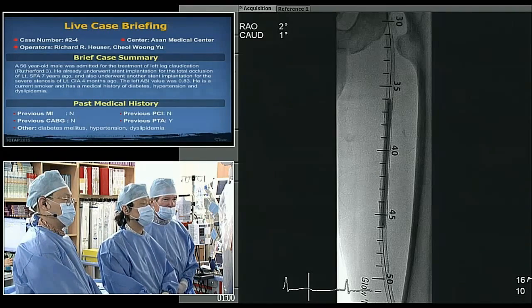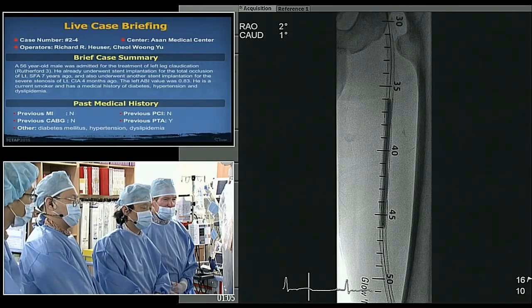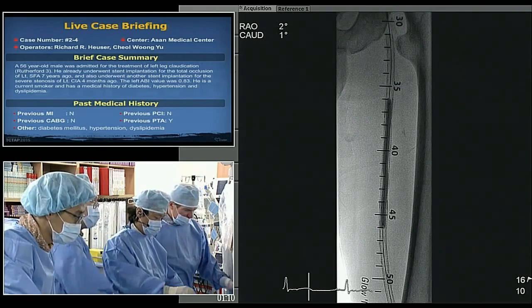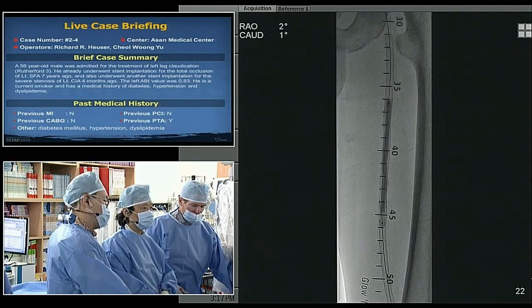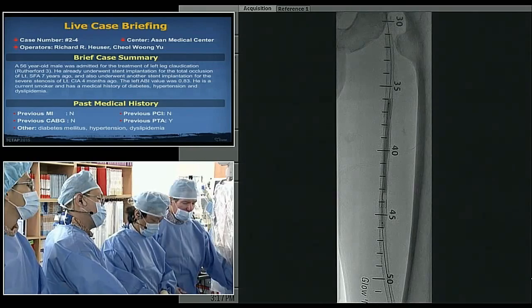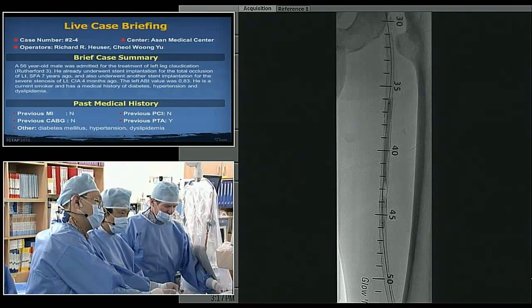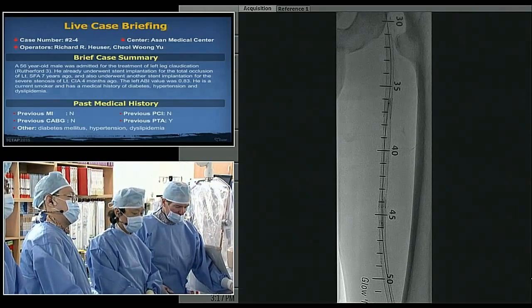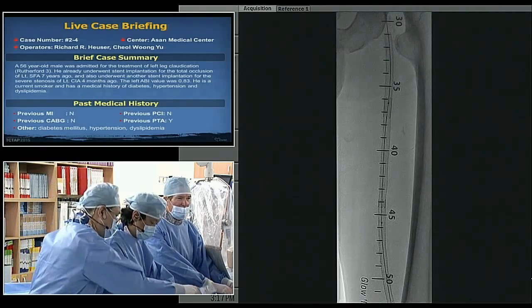In this case, if it's really a chronic occlusion, which we can estimate from the duration of the patient's symptoms, we can use directional atherectomy like the TurboHawk device. If it's rather subacute or even fresh, we have big experience with the Rotarex, a rotational thrombectomy device, which can also remove more organized material, not calcium, but neointimal material.